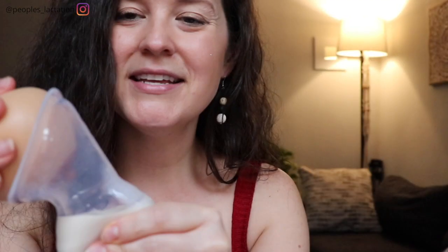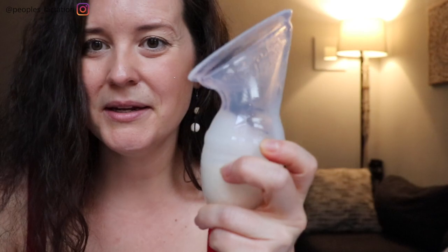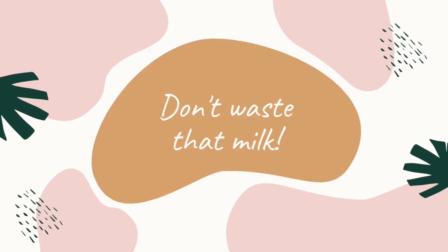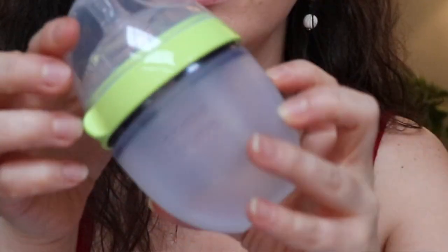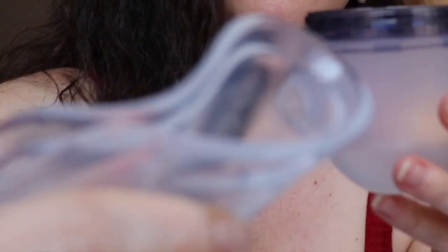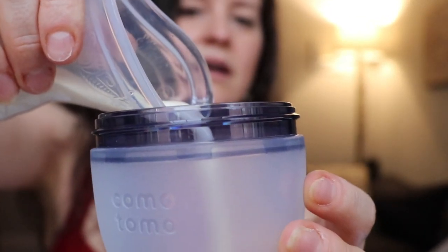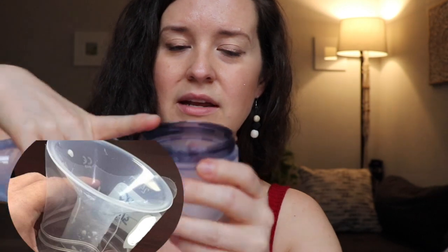Once you're done pumping, go ahead and squeeze it a little bit to remove the suction, take it off, and you should have a pretty good little collection of milk. You can go ahead and transfer it over to a bottle or a freezer bag. If you have a wider bottle like this Komotomo bottle, you can just give the pump a squeeze and pour it in. Another hack for transferring milk to a narrower-necked bottle is to take a regular flange from your mechanical breast pump, flip it upside down, put it in the top of the bottle, and pour through the flange using it as a funnel.